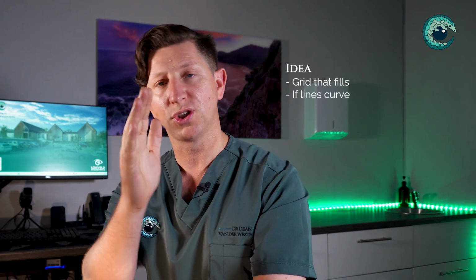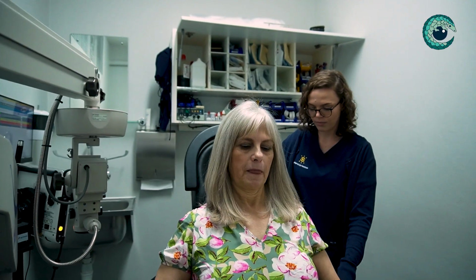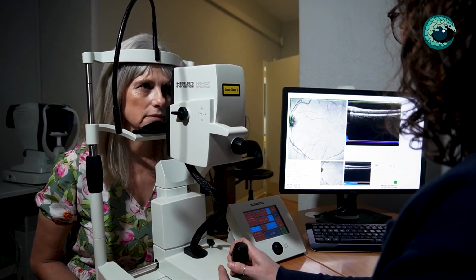If you start to see lines curve or change shape or become distorted, it's a way of monitoring. Especially in patients with AMD who we are monitoring, it's often not practical to see that patient every week or every month. It's just not practical for the patient. So we normally have routine visits where we do retinal scans to look closely at the macular area.